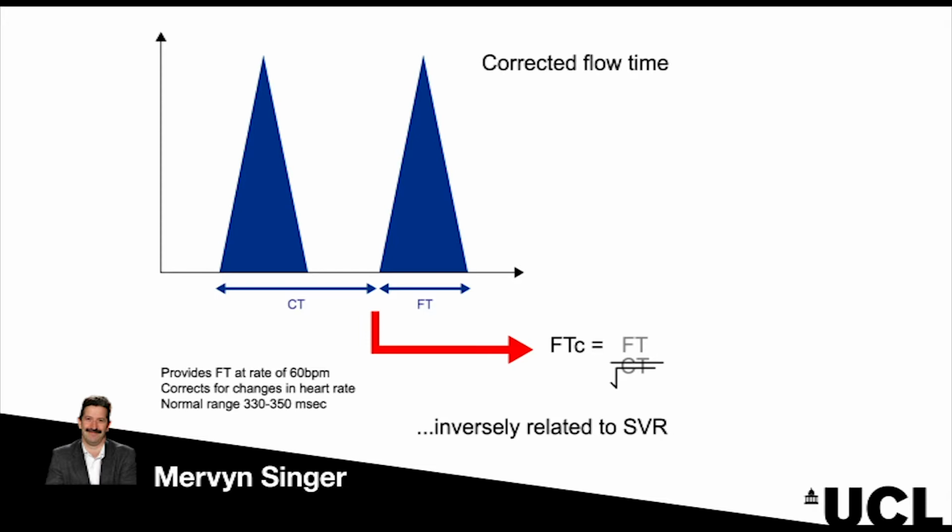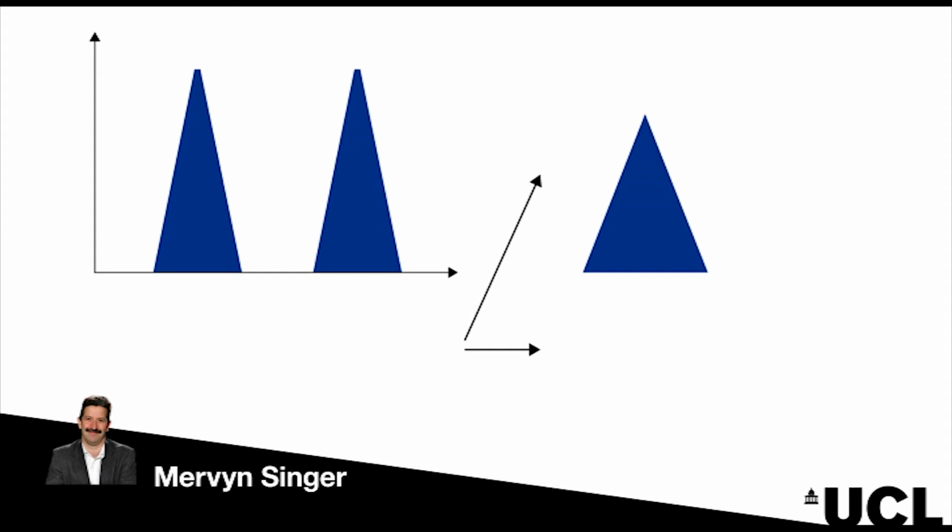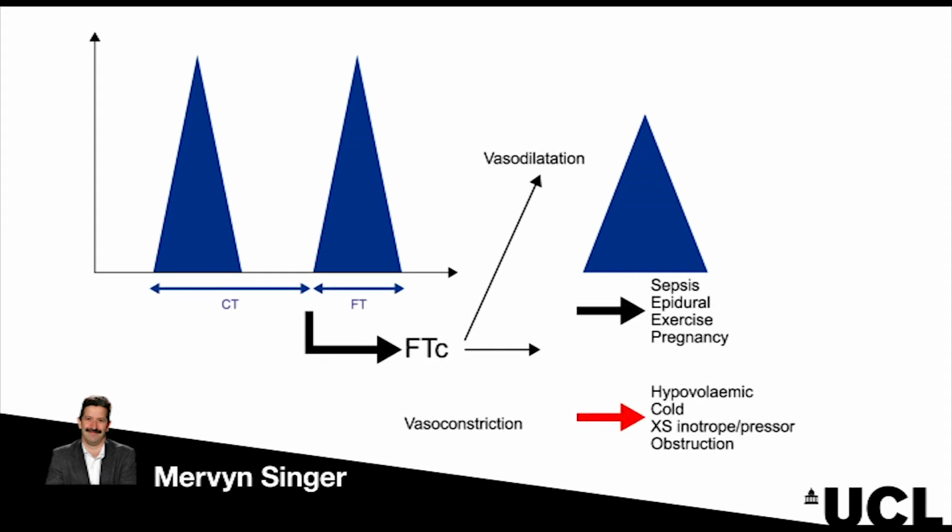And so at a heart rate of 60, systole is approximately a third of that. So that's 330 to 350 milliseconds. A third of a second is the normal time of systole in a patient with a heart rate of 60 beats per minute. And that value, this corrected flow time value, is inversely related to the systemic vascular resistance. So if the patient is vasodilated, there's a low vascular resistance, so the left ventricle can pump harder and longer. So if the patient is septic or is exercising, has an epidural in place, is pregnant, any cause of vasodilation, the peak velocity goes up and the corrected flow time gets longer.